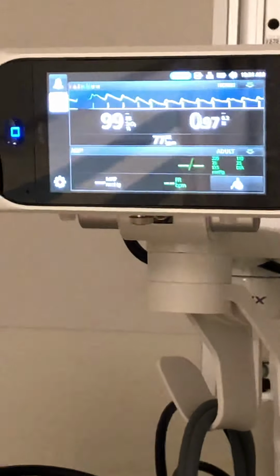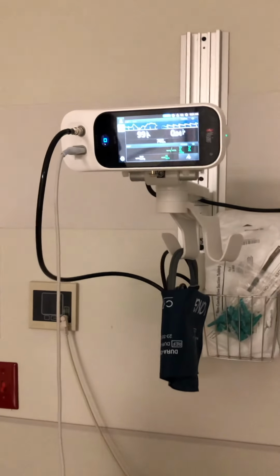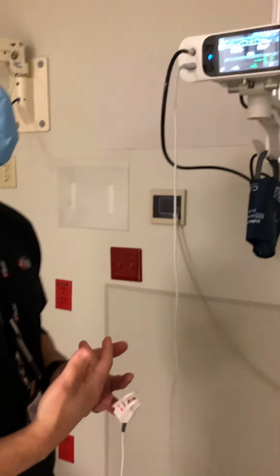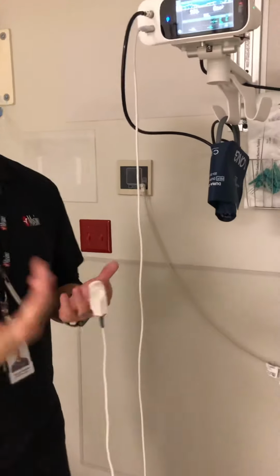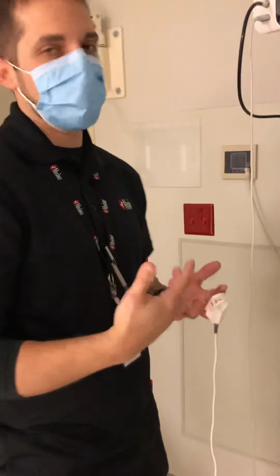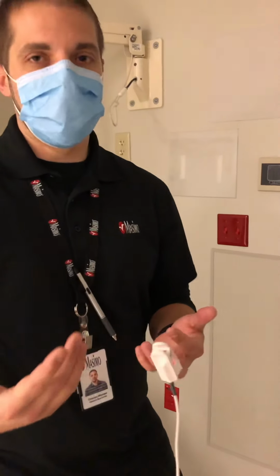Okay. So PI stands for perfusion index. It's a number or a value that can range anywhere from 0.02 as high as 20. We typically say that if your perfusion level is greater than 1, you have good perfusion at that site, okay? What I'm not trying to say is that if your perfusion is less than 1, that you can't trust your saturation score. You actually can. It's just more or less an indication that maybe your patient has lower than normal perfusion at that site.